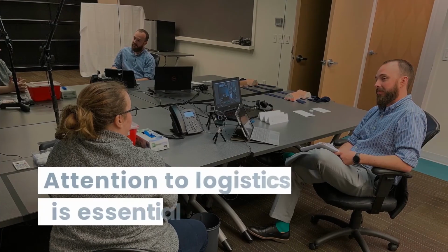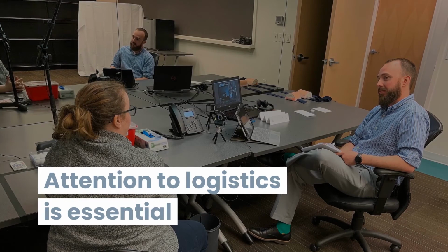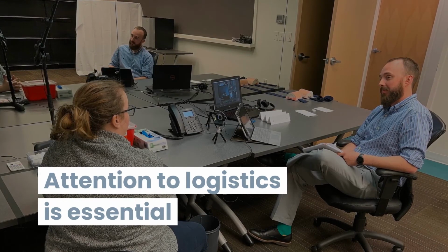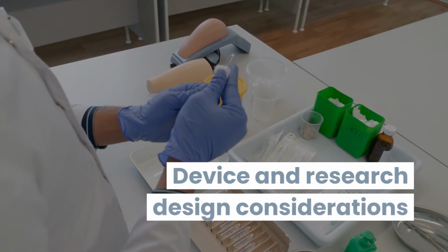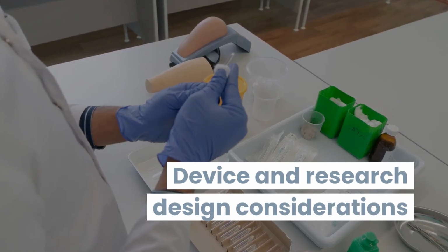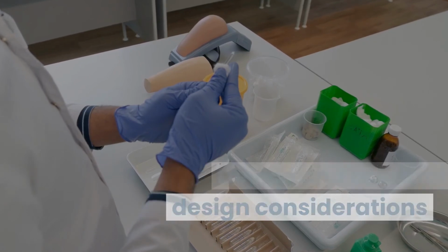Thinking through logistics is key to successful research. For example, are you using a placebo versus live drug? Do you need refrigerated storage? What type of injection pad should be used? And is there a first aid kit in the test room? Some human factors considerations include the injection site and angle, drug volume and viscosity, the plunger or flange design, storage and package design, dose and drug differentiation, and the IFU design.